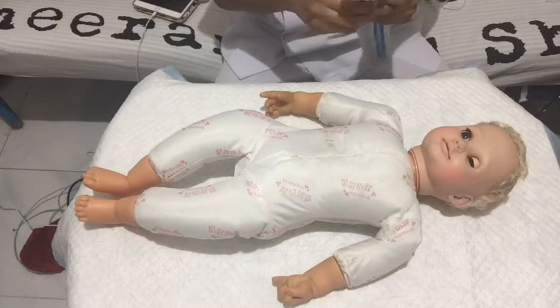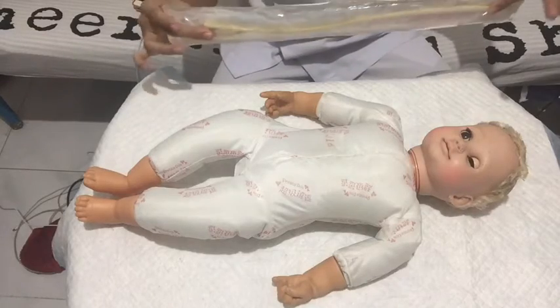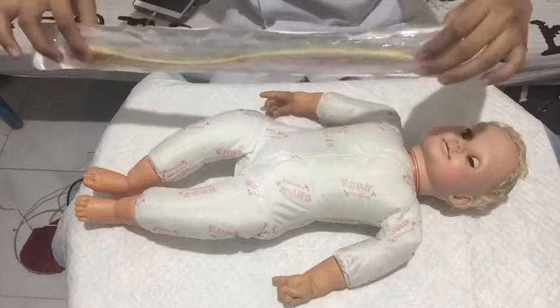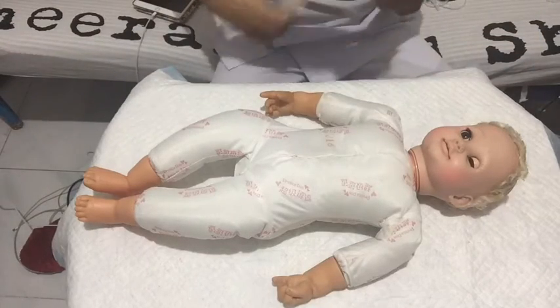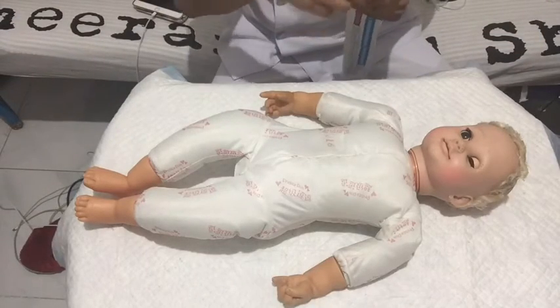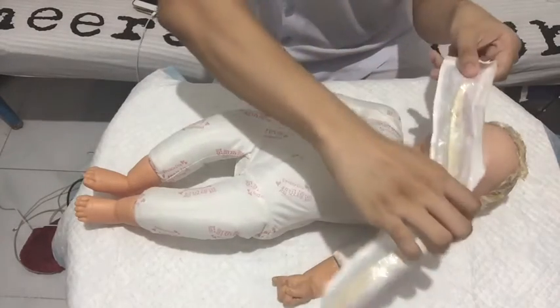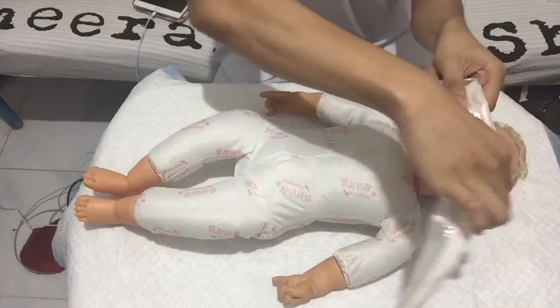When we estimate the length, we always have to remember that the catheter has to still be inside its sterile container to avoid infections. So when doing this, we have to measure from the nose. We can measure from the nose to the earlobe, or the nose to the mandible.